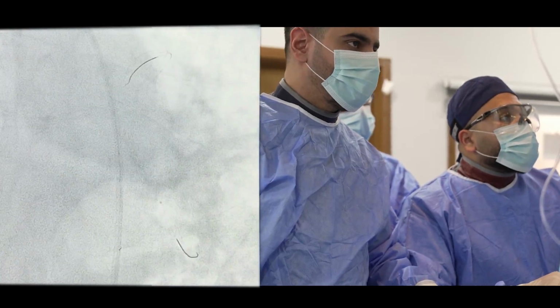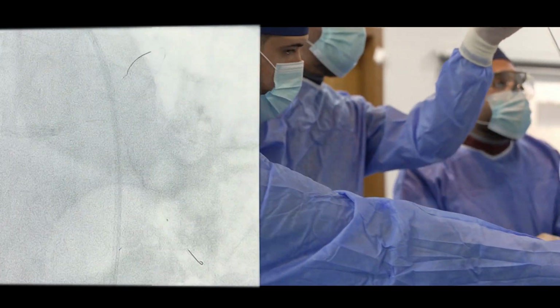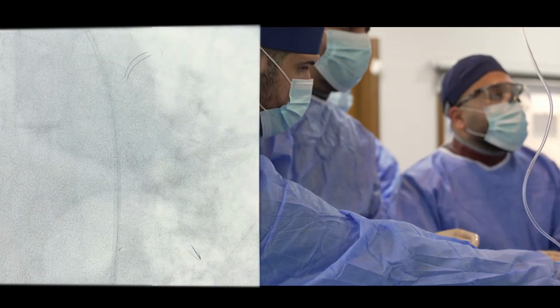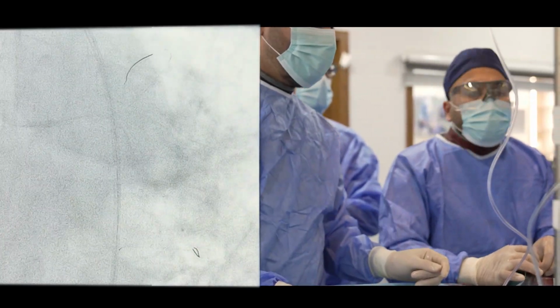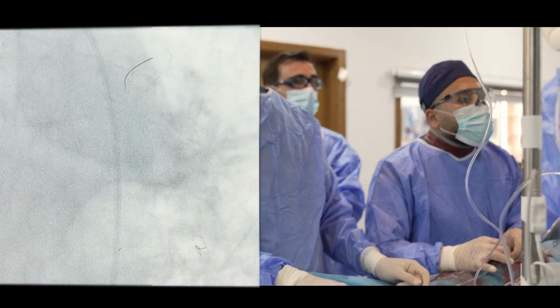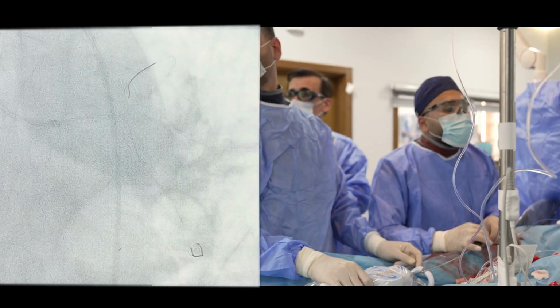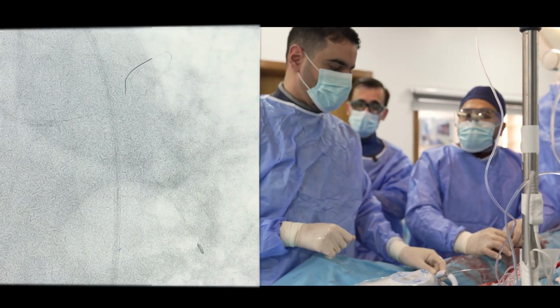More. Okay. Imaging. Okay, little bit more. Okay. Stop, pull back. Now camera on the IVUS.